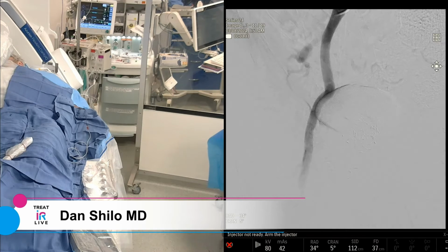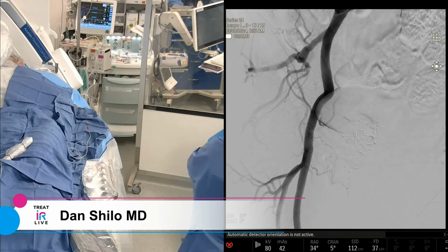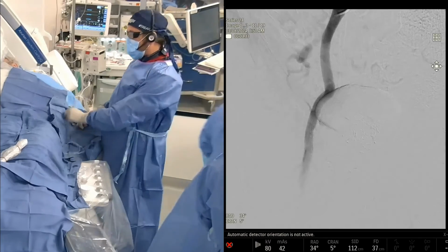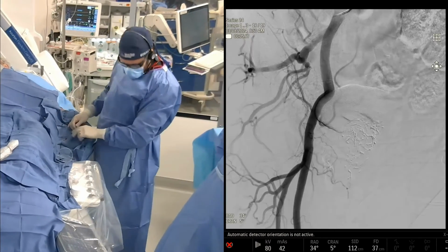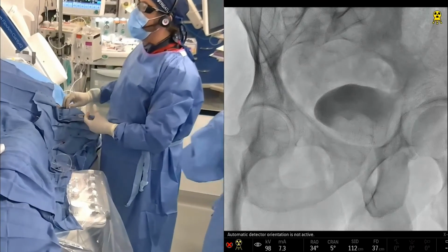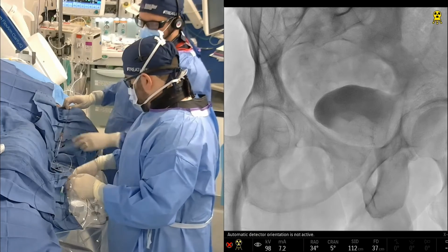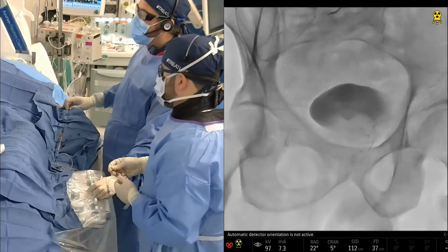It's usually, we pulled back too much on that, unfortunately. Sometimes we try to get a little greedy and we pull back because we want to see the SVA origin, but this origin's a little too steep. Let me see if I can just puff it back in there. We're going to ask Dan to do that again. I mean, again, crux of the case, right?